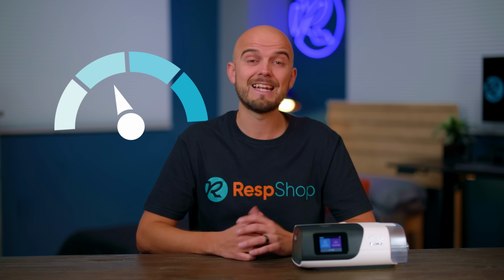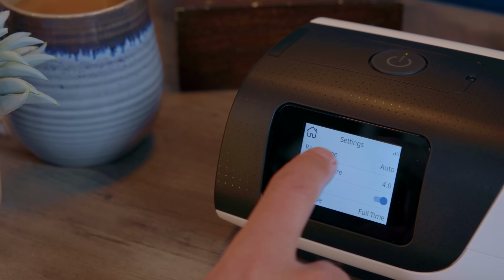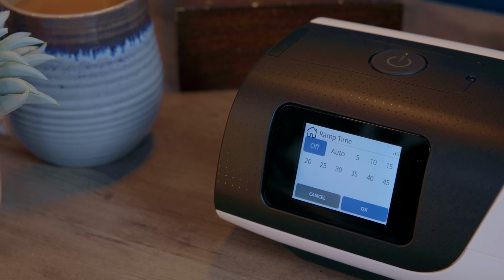But it then needs to let the air pressure reach those levels once you're asleep to keep you sleeping. Ramp is all about comfort while you try to fall asleep. When you click on Ramp Time, you will see Off, Auto, and then a series of numbers going up in 5-minute increments from 5 to 45. If you have this off, then your prescribed therapy pressure will begin as soon as you start therapy. In other words, there is no ramp time.